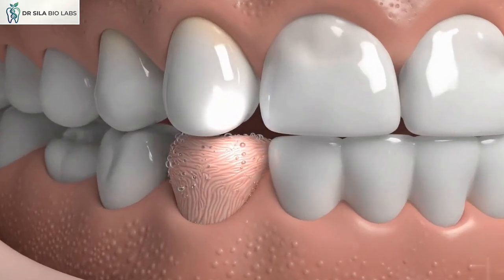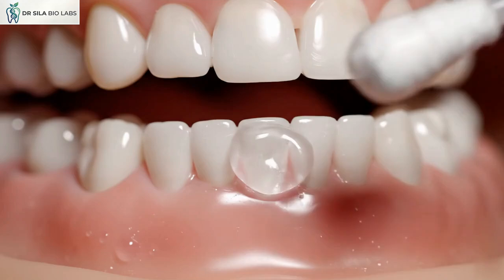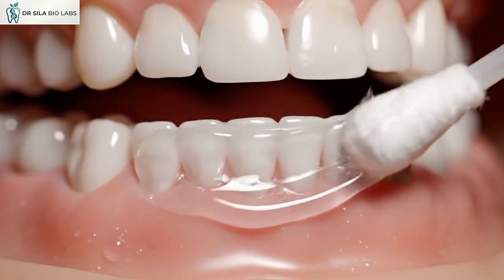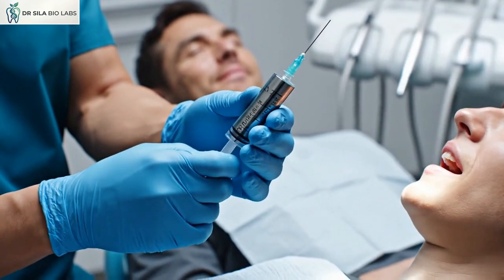Before root canal treatment can begin, the tooth must be prepared carefully. The first step is the administration of local anesthesia, which numbs the tooth and surrounding tissues to ensure the procedure is comfortable for the patient. We're ready for the anesthetic now. You're doing great, just relax.